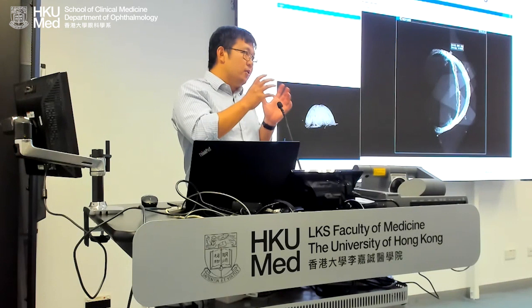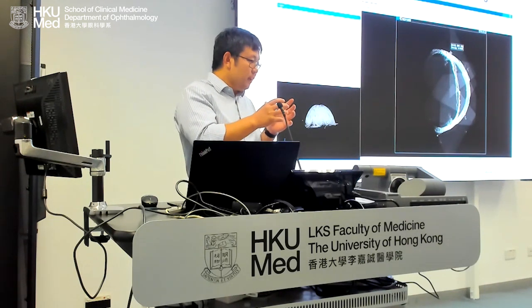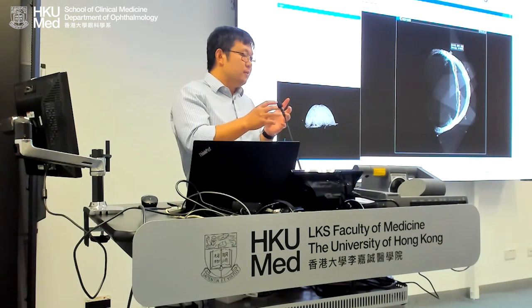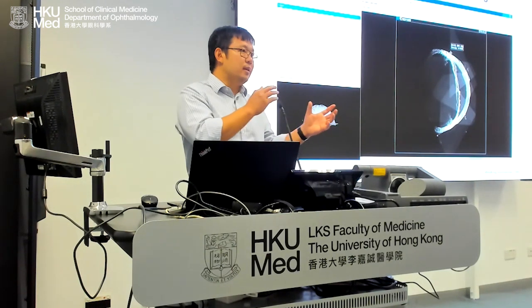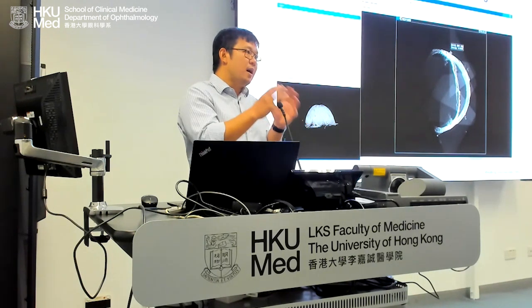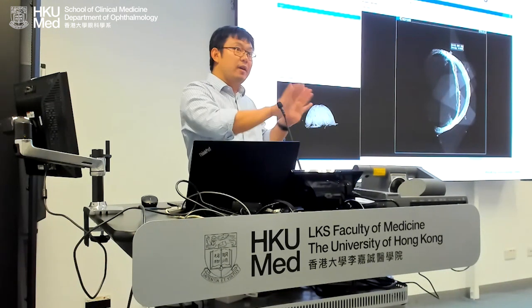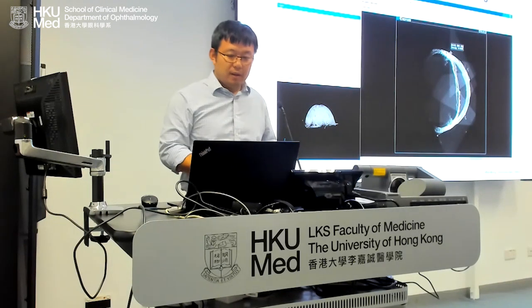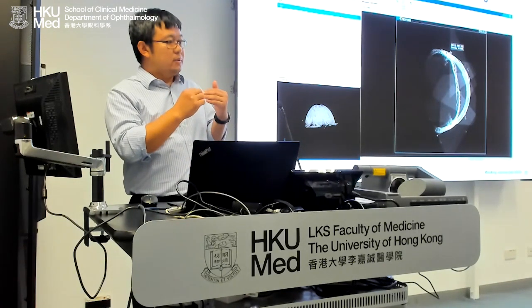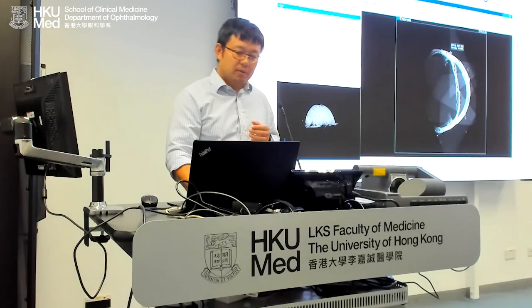Robots are also never accurate enough if we rely on them for surgery. It's accurate enough for car assembly because the requirement is at the level of millimeters to centimeters. For eye surgery, we need an accuracy of microns or submicrons. It's a different scale, a 1,000 times difference. So we have to develop tools to align them correctly to provide any surgical guidance.